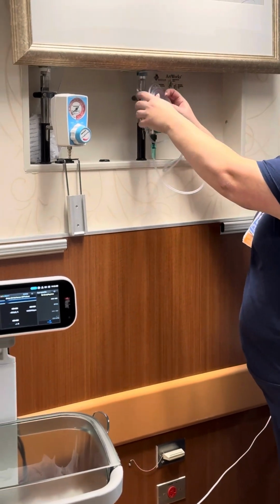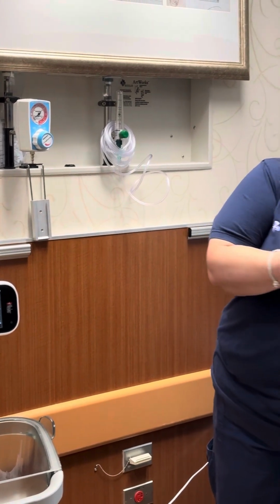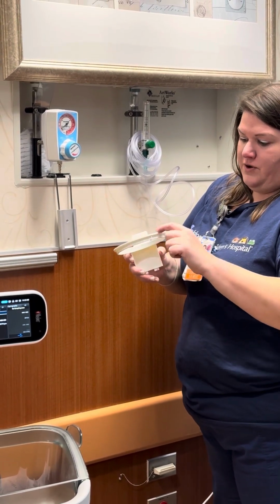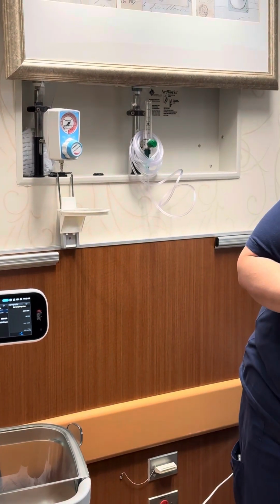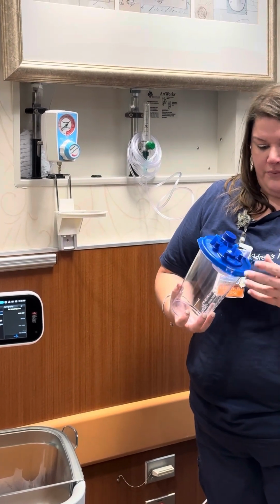To do your suction setup, you need a couple of things. So you're gonna need the white ring. This is what's gonna hold your suction canister. So there's like a rim, and the rim goes on the top. So you're gonna slide that into this silver holder on the wall. You're gonna get your canister and make sure that your top is pushed on all the way.